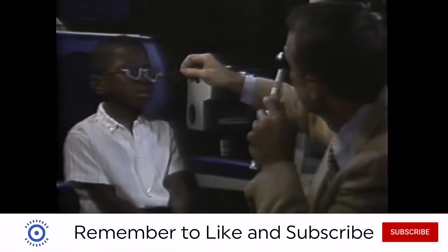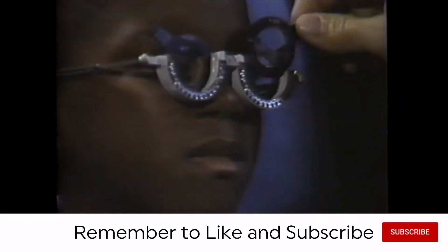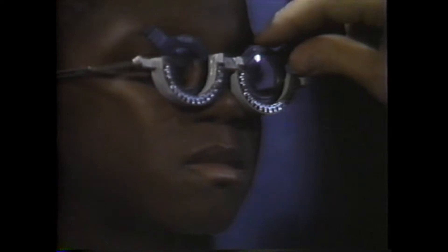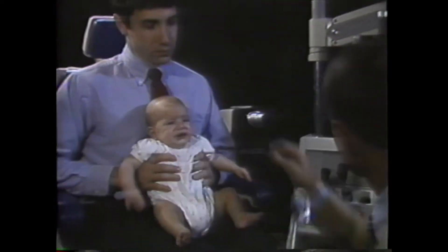Retinoscopy is often performed without the phoropter, especially with children. Trial frames can be used if the child is cooperative enough, or the lenses may have to be hand-held, especially with infants. Turning all the lights totally off in the room and making barking or other noises to attract attention will also help with infants.